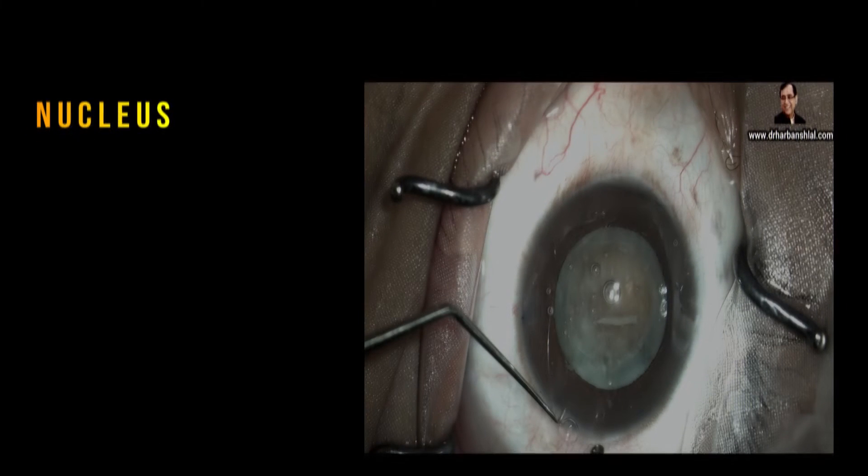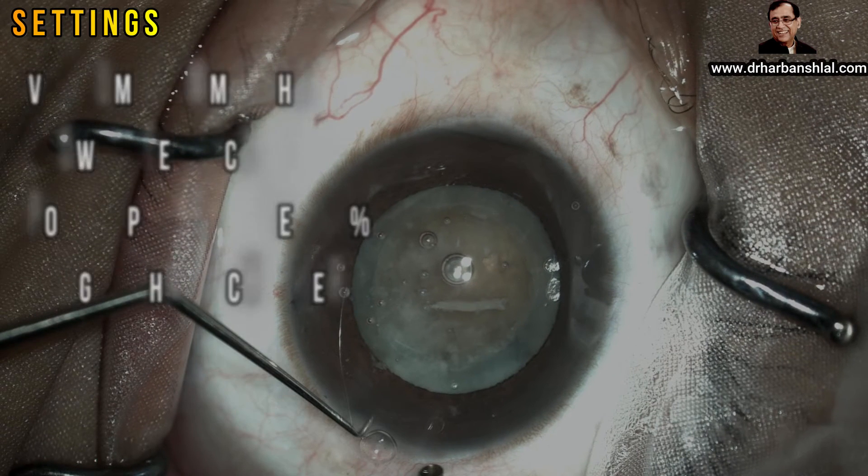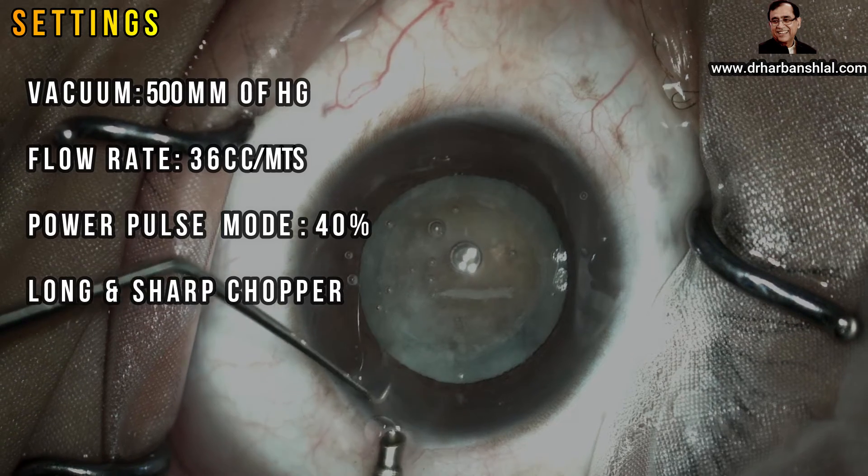A hard cataract may be considered to have two nuclei: one central core called the endonucleus, surrounded by the exonucleus. While doing direct chop, intentionally or unintentionally, you may hold the exonucleus and chop it, leaving the endonucleus intact. In such scenarios, this technique is extremely safe and useful. Now watch the video. We are going to operate with vacuum setting of 500 millimeters of mercury, flow rate of 36 cc per minute, power in pulse mode at 40 percent.